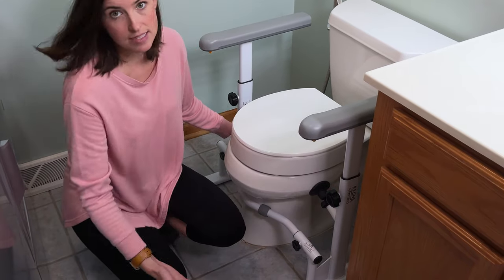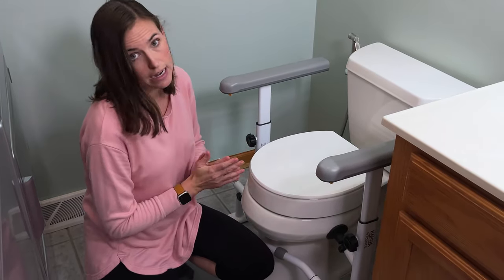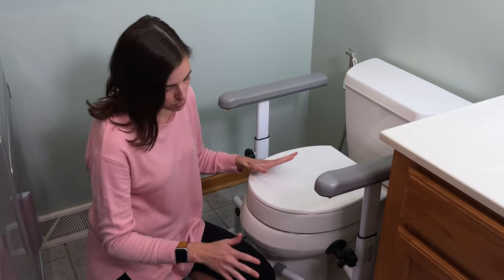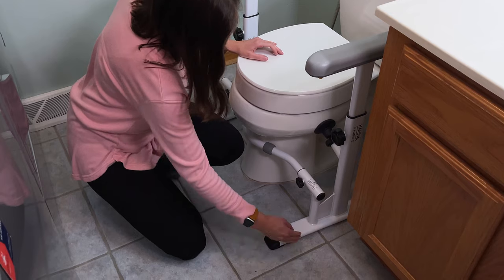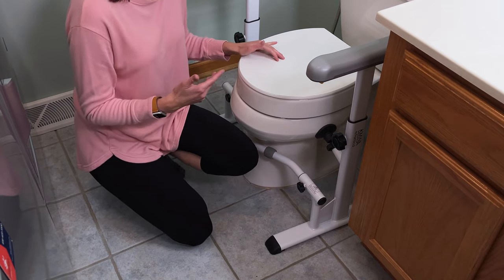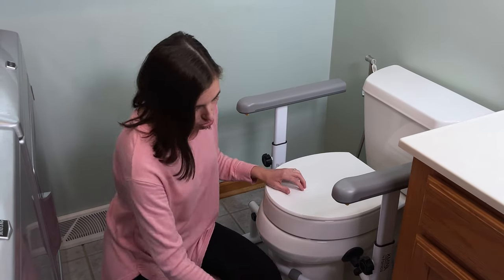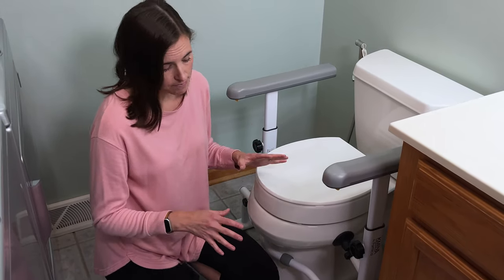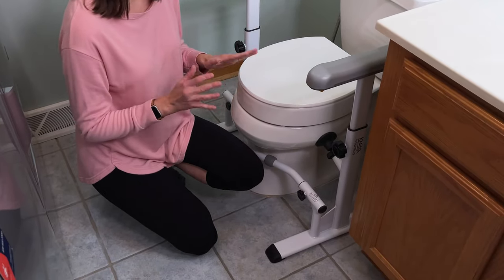So now we can test it — just do the jiggle test. That's not going anywhere; this is a very secure setup. I do want to point out one downside: the feet do stick out a bit beyond the base of the toilet and could become a trip hazard for some individuals. So if you're working with somebody who has low vision or perhaps some cognitive deficits that might impair their ability to adjust to having these feet present, I would suggest considering different options. But for those who can adjust, this is still a fantastic supportive toilet safety frame solution.